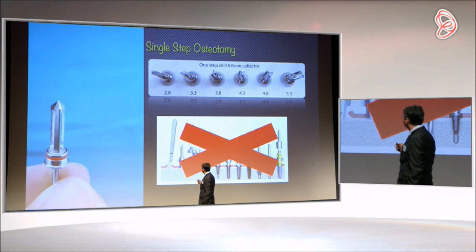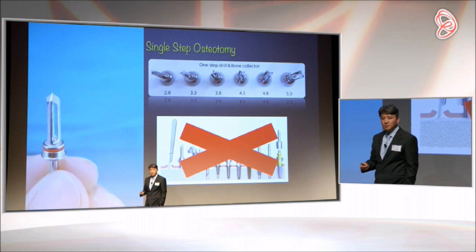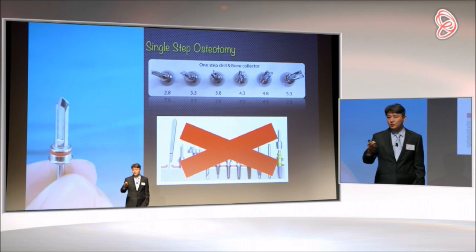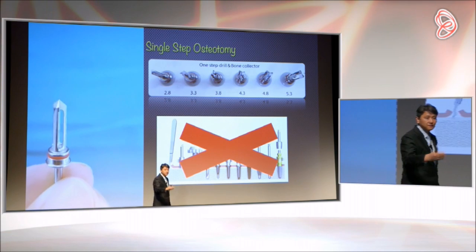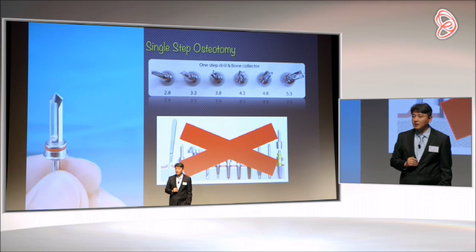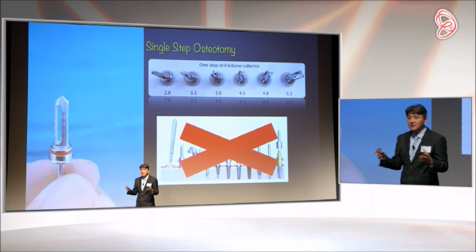If you are using 4.5, then I recommend a 3.8 millimeter burr. Now, those of you who use a different implant system, you can use this burr and then use a two-step osteotomy technique. So you can finish your final osteotomy with your implant kit that you are using. But still, it will save a lot of time.